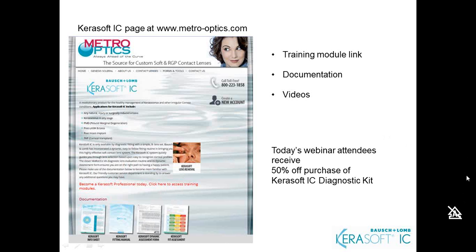However, you can order this lens thinner, and I will order this lens thinner, especially in cases of low cones and pellucid and corneal transplants, where I need this lens to drape more effectively. I will order the lens in the thin design, and you can just talk to the lab, and it can get as thin as, I believe, 0.25, Steve? Yes, you can get it on the thinner side. You can order a custom thickness at a 0.25 typically.